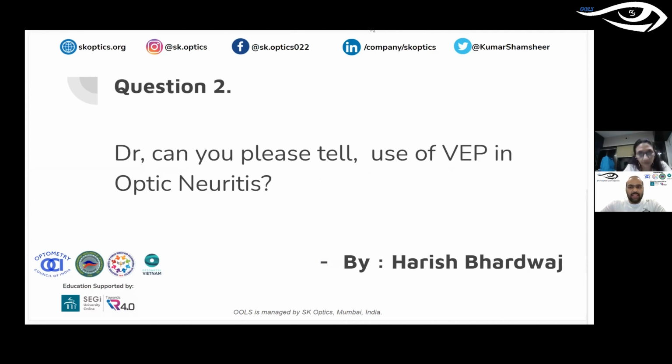Correct. Yeah. And let's look at the other question here. Could you please tell us the use of VEP in optic neuritis? How would VEP help? In fact, VEP is the test done for optic neuritis. What is a VEP? It's a visual evoked potential. That means if I put a flash of light on your eye, your optic nerve is going to carry some signals. Your retina is going to carry some signals. Those signals go to the brain and they are recorded. And that recording is called visual evoked potential.